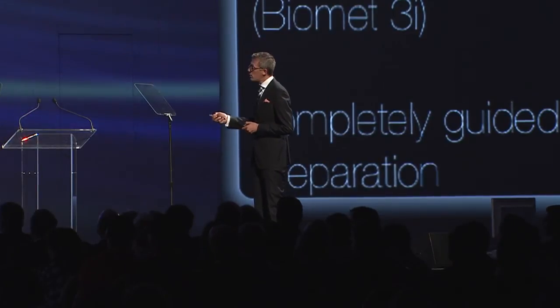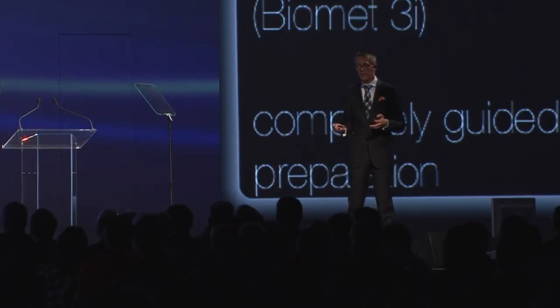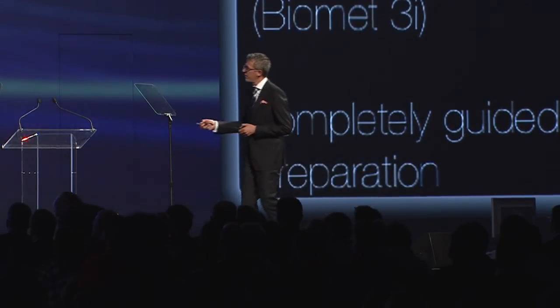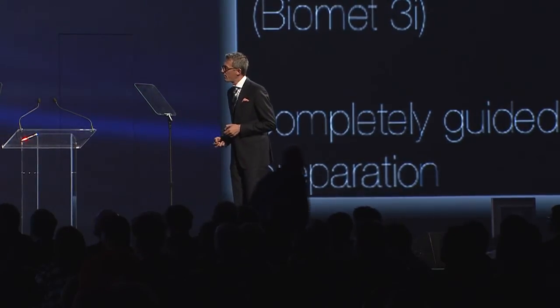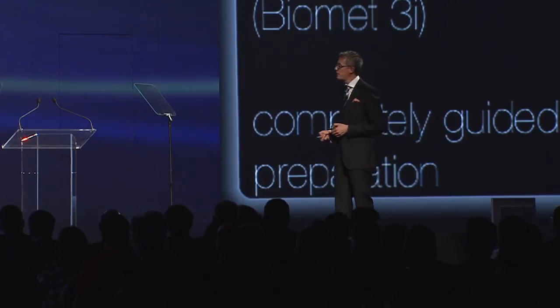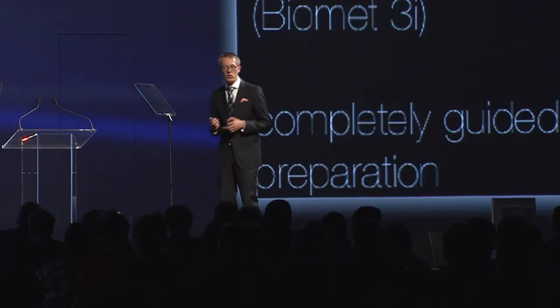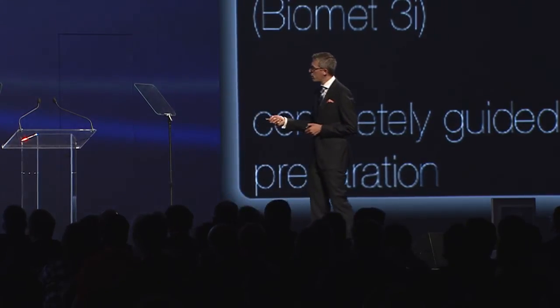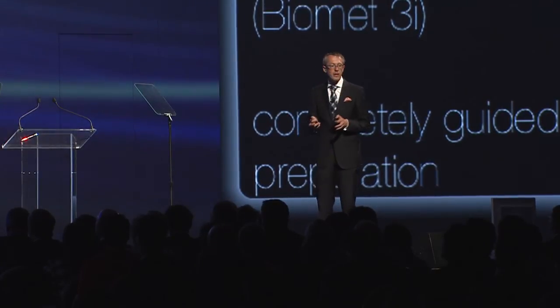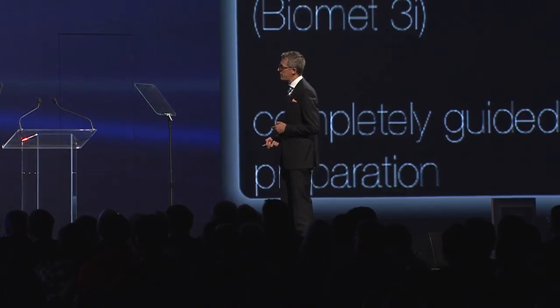A closer look: you can combine this surgical guide with the major brands of completely guided implantology. For example, there's the Navigator system of the Biomet 3i company. So when you are ordering this surgical guide, you have to select if you would like to do it completely guided and which system you would like to use. I ordered the Navigator system, and the CEREC company placed these original sleeves for the completely guided Navigator system.